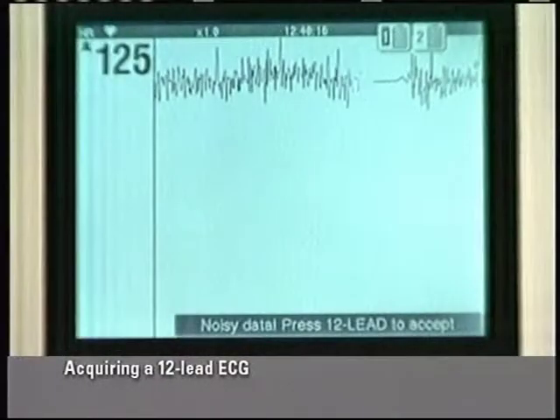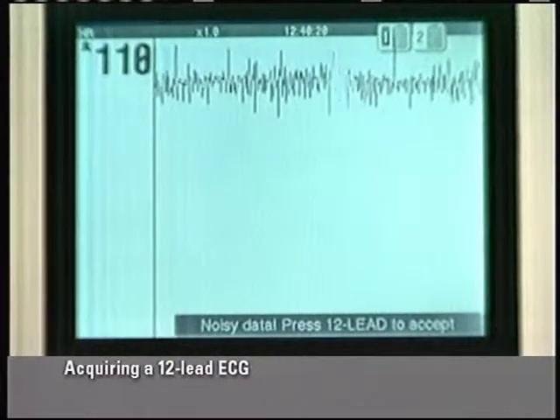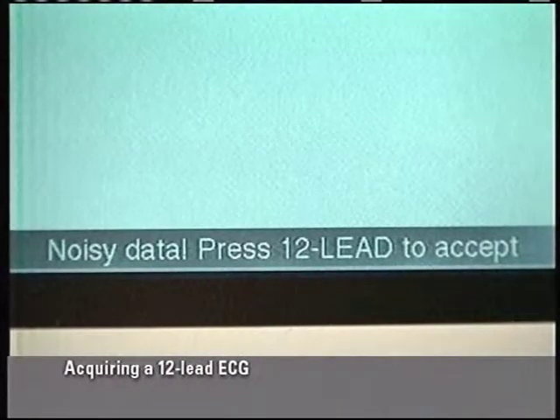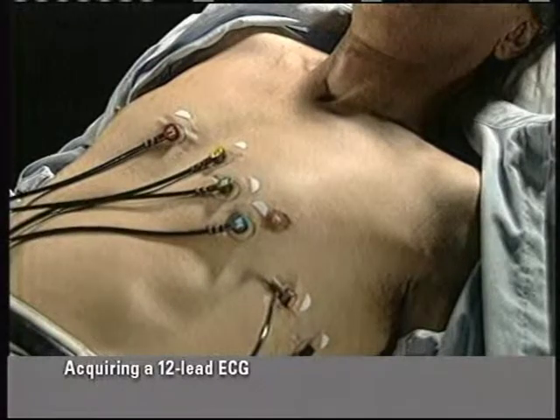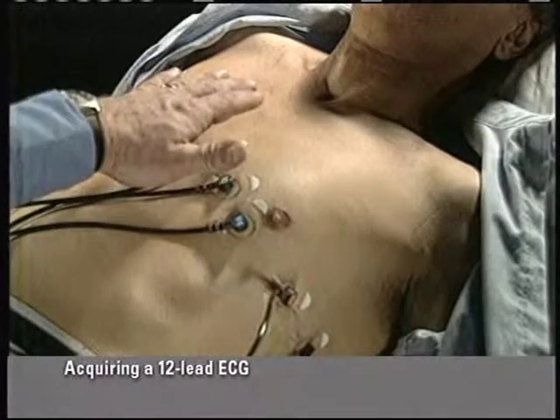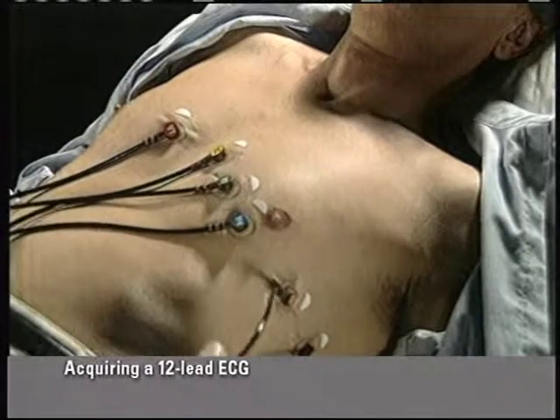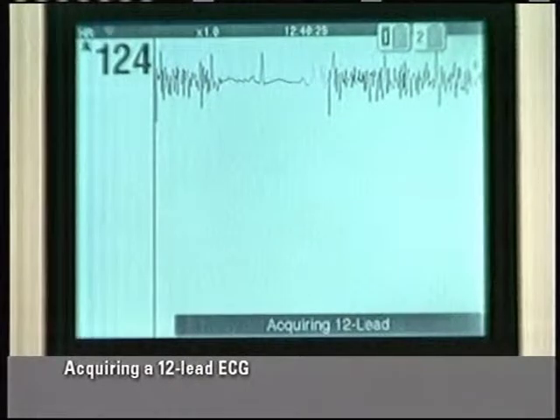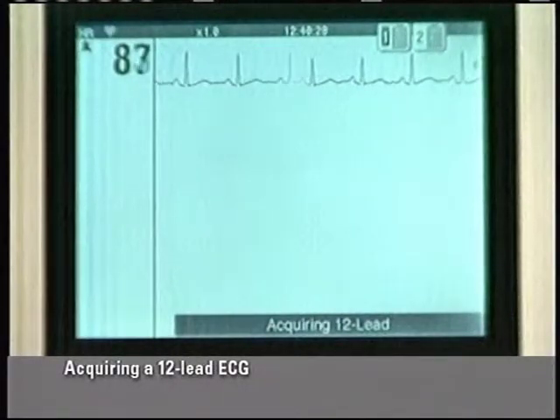If the monitor detects a noisy signal or ECG leads off condition while acquiring the 12-lead ECG, the message "noisy data, press 12 lead to accept" appears. Check whether the patient is relaxed. Ask the patient to lie quietly. Check electrode contact or reposition lead wires to eliminate the signal noise. The monitor resumes acquiring the 12-lead ECG as soon as the signal clears.